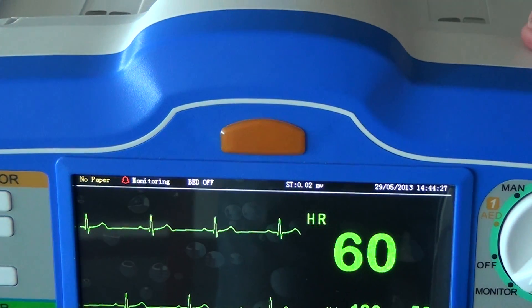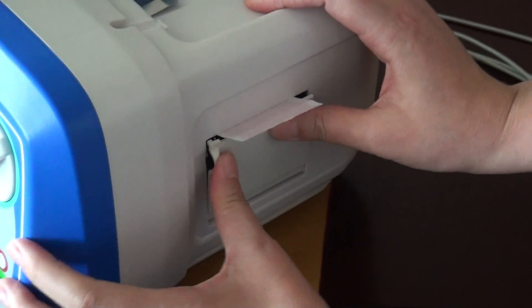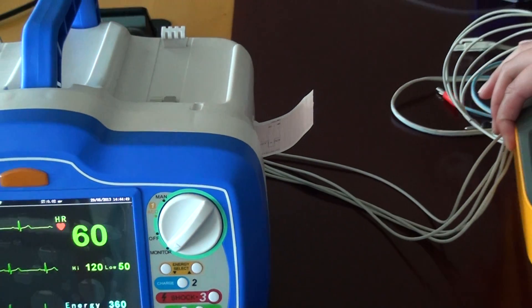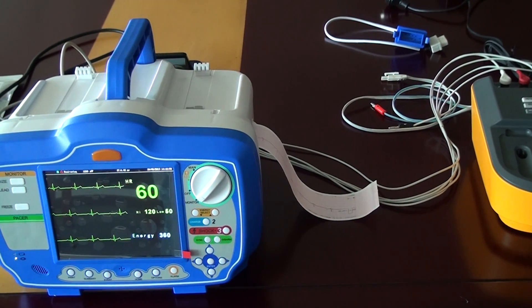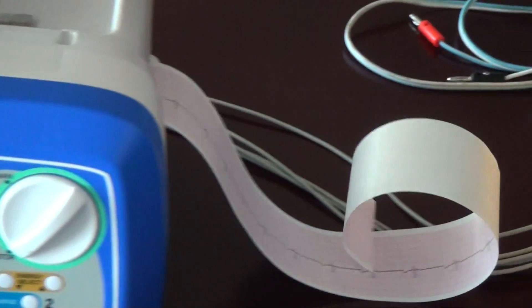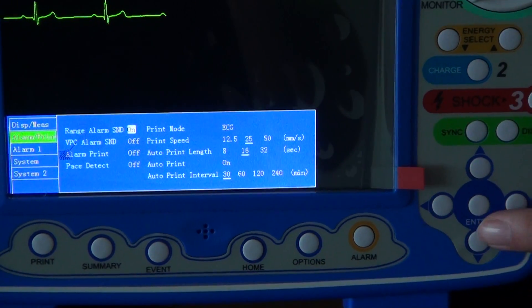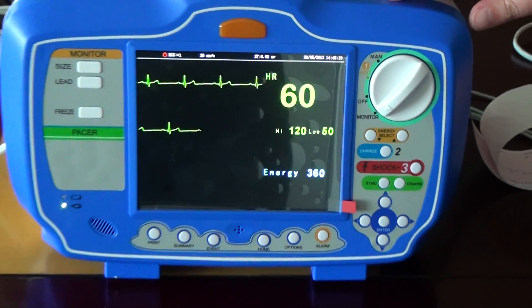Because there is no paper, it shows 'no paper'. Now we put the paper in the device and press print to print the report. For the print length and speed, you can press enter to go to settings, then alarm print to set the print, and press home to go back.